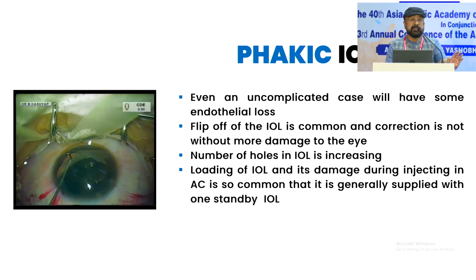Now, tell me one thing: if the patient has hypermetropia, the anterior chamber is going to be shallow. There'll be crowding of the angle. Where will you put the IPCL? The company says for its own sale that you can go up to an anterior chamber depth of 2.8, but I'll never do it if it is less than 3 millimeters.